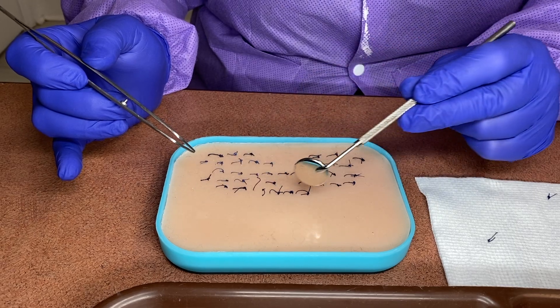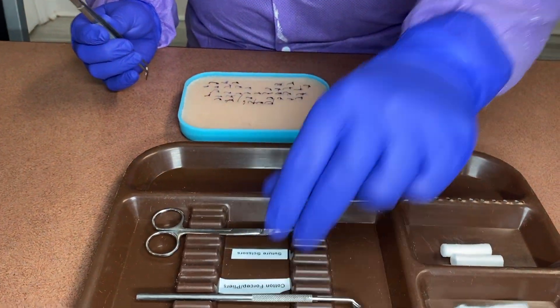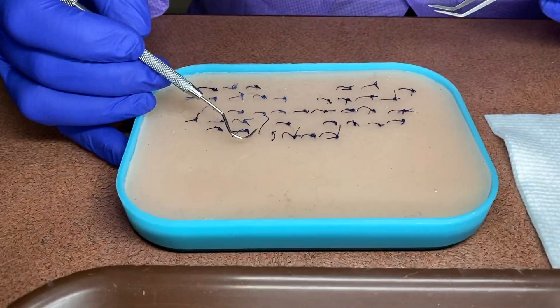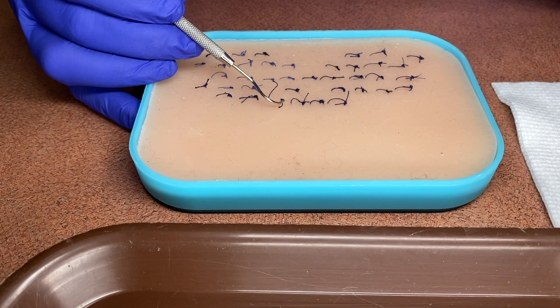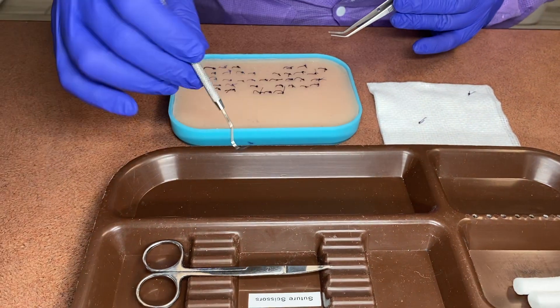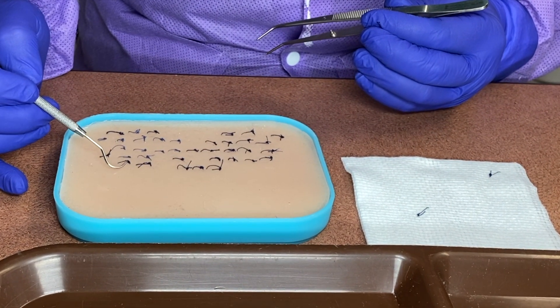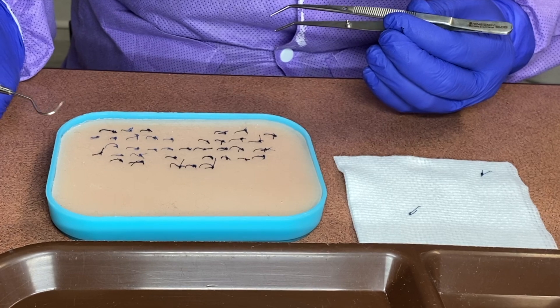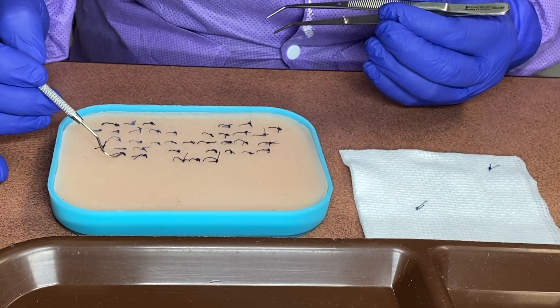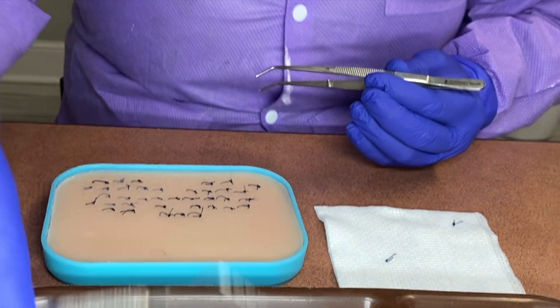If the tissue has grown over the suture, we need to get the doctor for anesthesia. So we always want to look first before we go in to just remove. The explorer can be used to help us remove the suture if it's already loose. You never want to just go in and tug on them — it can be painful for the patient. You never want to just dig at the tissue around the suture.